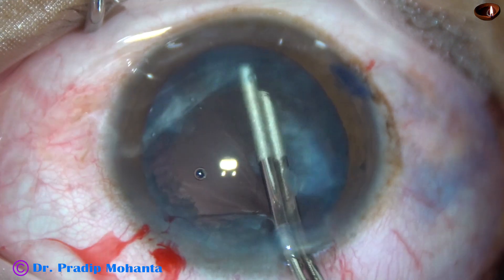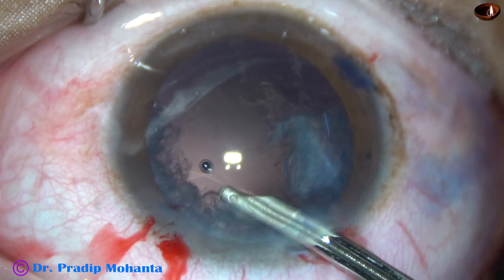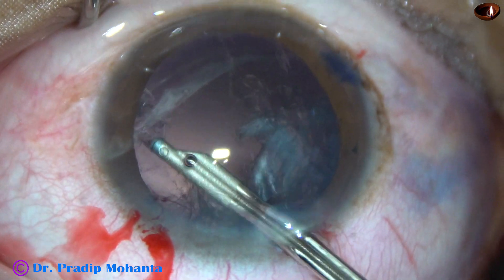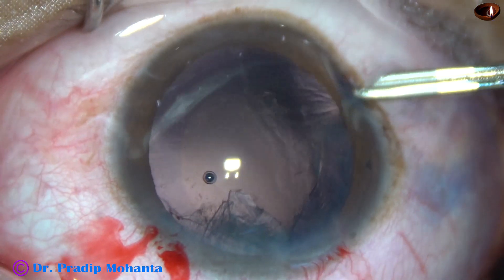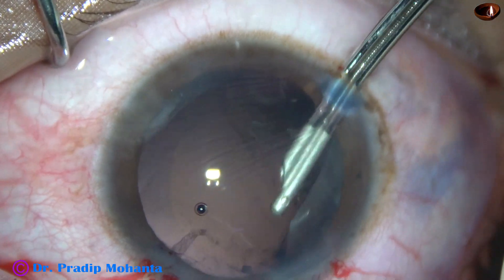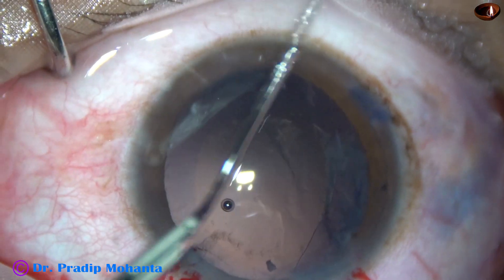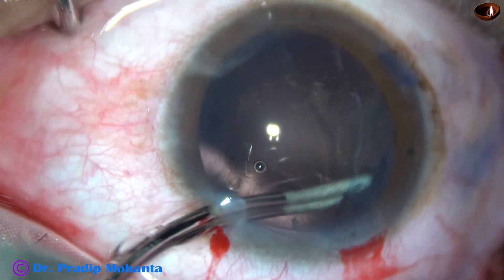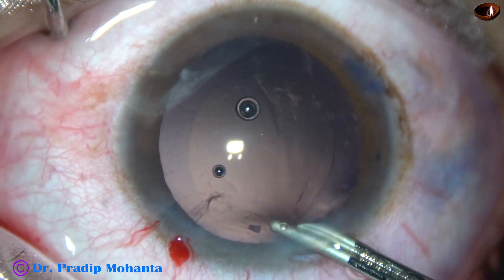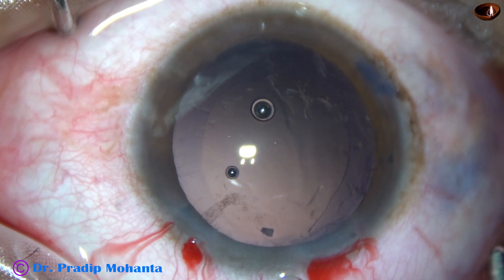And now the rest of the surgery is as usual. Cortical cleanup is being done with the help of the Simcoe cannula, because it is much safer than bimanual irrigation aspiration when the rhexis has gone to far periphery. Bimanual irrigation aspiration can be done, but we should do it with very much care — decrease the bottle height and do it very slowly. With the Simcoe, I get more control in such cases and you may also find it safer in your surgeries.